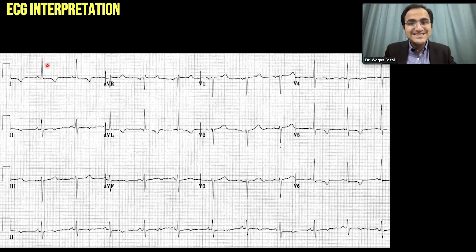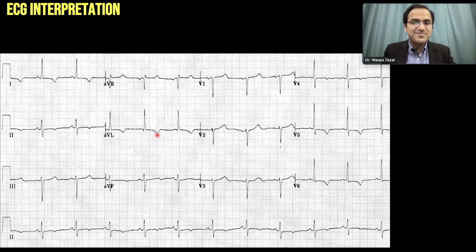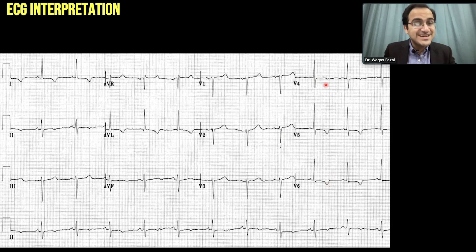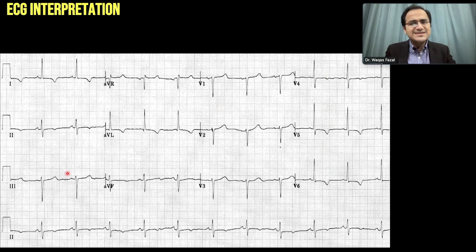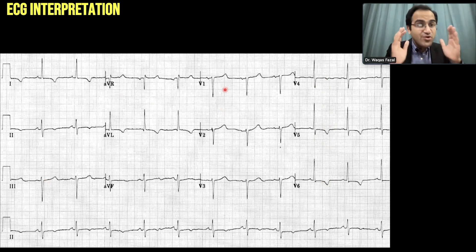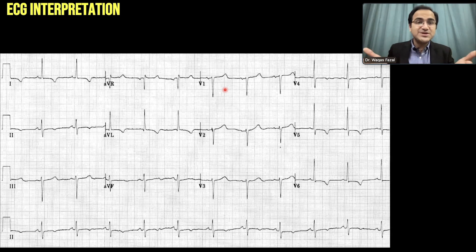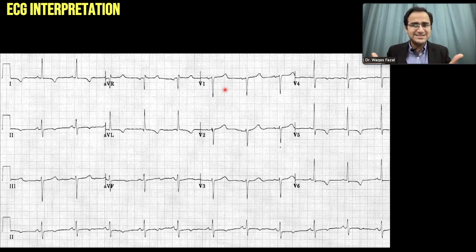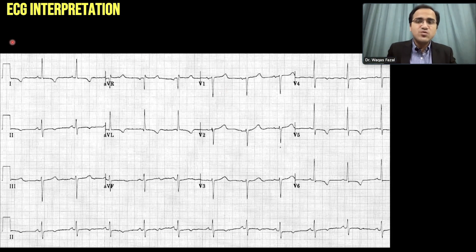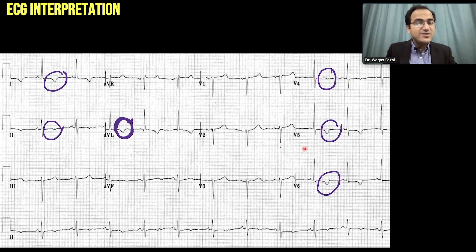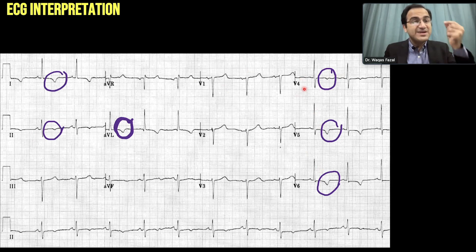Looking at this ECG, there is T wave inversion in lead 1, lead 2, AVL, V4, V5, and V6 — that is the classical T wave inversion indicating subendocardial ischemia. Lead 3, AVR, and V1 are not considered. We have T wave inversion in leads 1, 2, V4, V5, and V6, which is a significant finding indicating subendocardial ischemia.